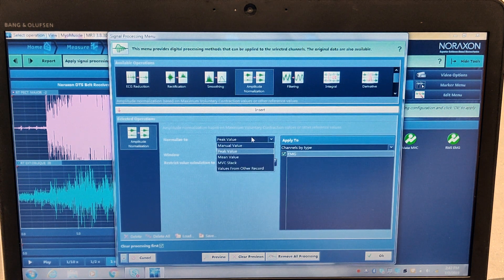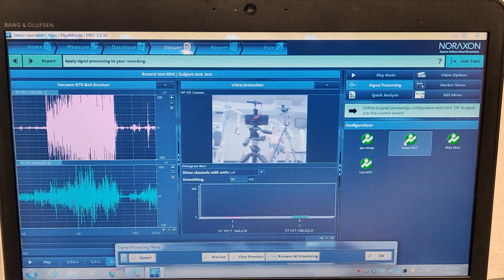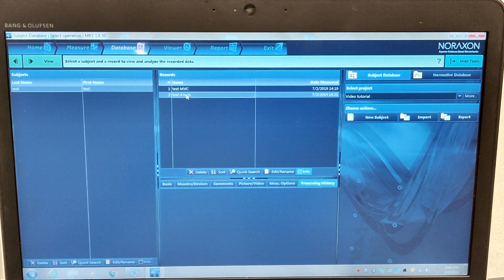We'll hit Amplitude Normalization, which is already selected to Peak Value — that's what you want. There are a couple of other options, but Peak Value is the one we're looking for. We'll normalize it to 100 milliseconds, which will give us a tight window to find the peak value. Then we'll hit Pick and say Make This an MVC. Once we click OK, the signal gets cleaned up and it gives us a green bar showing where the MVC was for each muscle — for the oblique it was right here, and for the pectoralis major it was right here in this green window. We'll go back into the database and hit Save Changes in the Records.